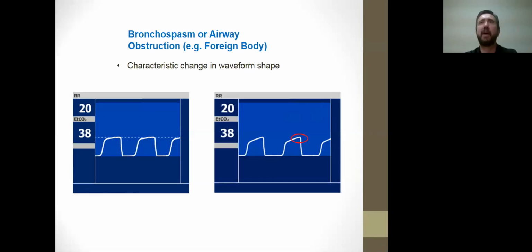You know, asthma values change with severity. So with mild asthma, the CO2 will drop below 35 as the patient begins to hyperventilate to compensate. And as the patient worsens, as we saw in that scenario in the beginning of this presentation, the CO2 levels will rise to normal, which is not a normal finding, by the way.